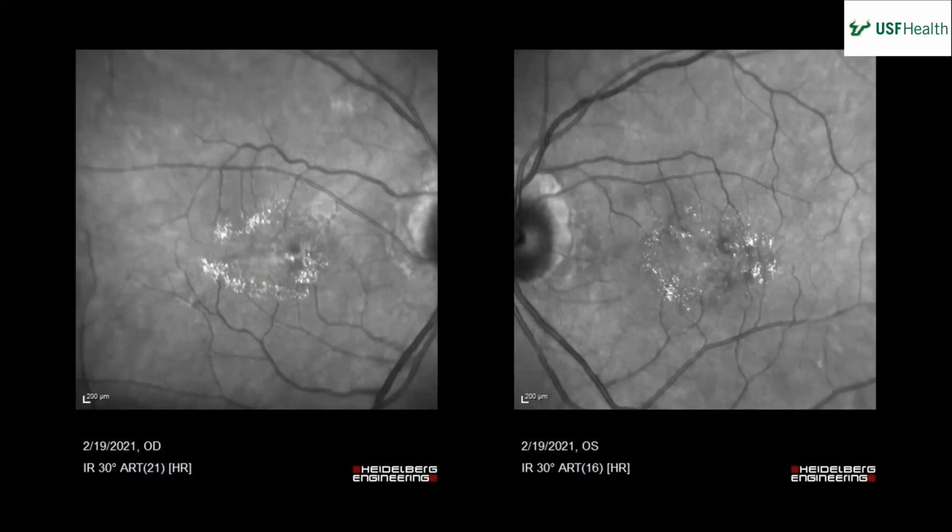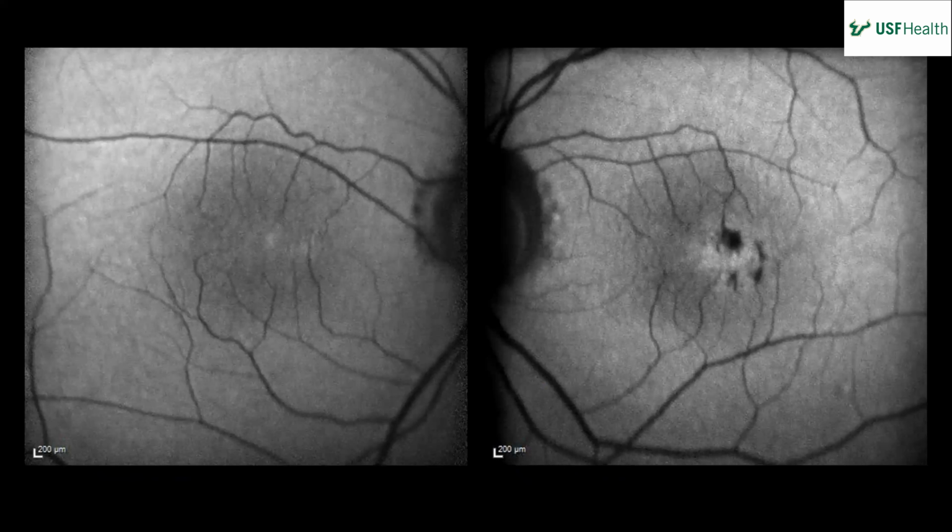All right, so some IR photos. What was that, hyper reflective? Yeah, use the word hyper-reflective. Yeah, so hyper-reflective spots where the yellowish pigment was in both eyes. That's really all. And is this autofluorescence? Yes. Why did you turn those on? Why would you turn everything down? I don't like it totally darker, but yeah, there's some hypofluorescence, especially in the left eye, in the macula.